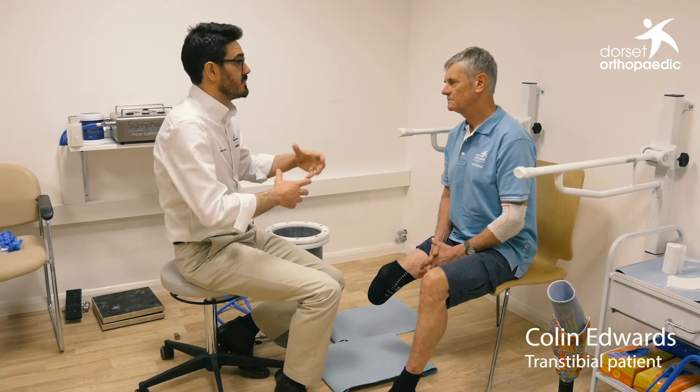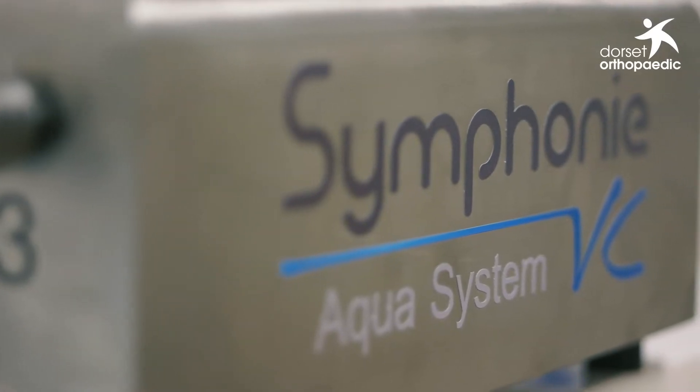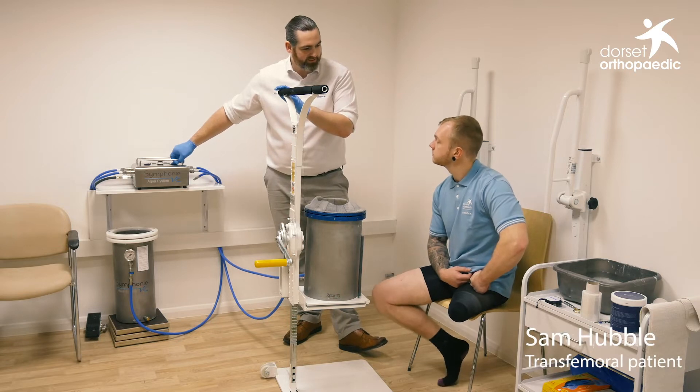Today we will have cast both the transfemoral and the transtibial patient and within two or three hours we'll be fitting those patients on a test socket. What we're doing is condensing the time they need to spend within the clinic, which is really important for them if they've got busy lives with work, family, and so on.